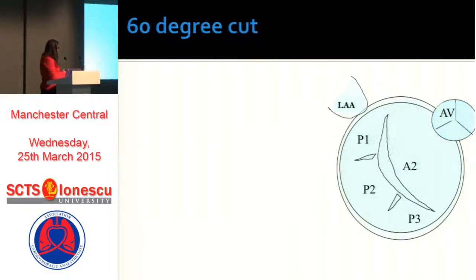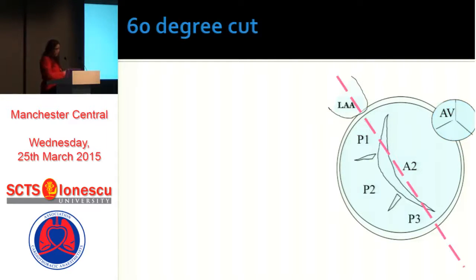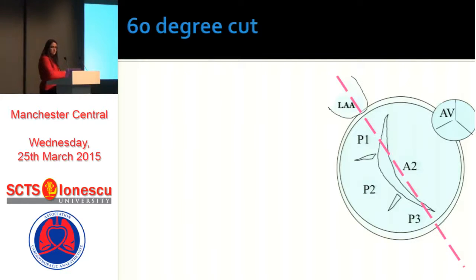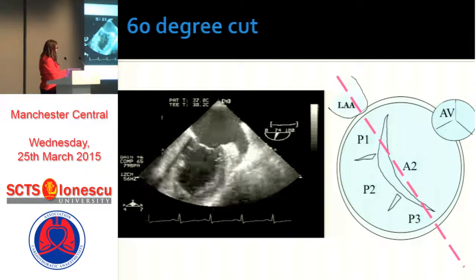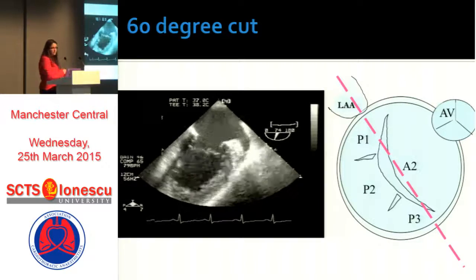At the 60-degree plane, you're cutting along the closure line — called the commissural view. However, the name is a misnomer because you don't actually see the posteromedial nor the anterolateral commissure. What you do see is the left atrial appendage, then P1, A2 in the middle, and P3 on the side.